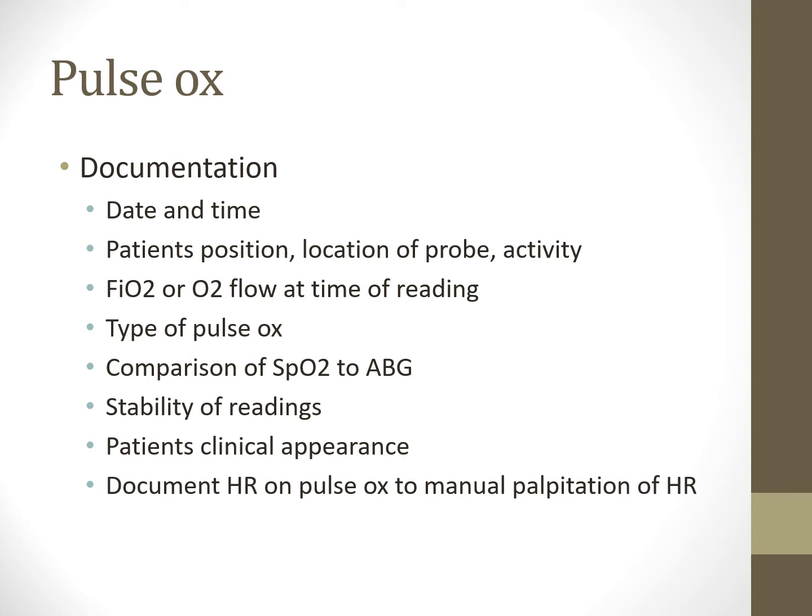So if they're on a continuous EKG monitor, right? So they're in the ICU and they're on a 3-lead, right? You can look at the heart rate on the EKG and compare it to the heart rate on the pulse ox and see how accurately your pulse ox is picking up the heart rate. If the pulse ox heart rate and the EKG heart rate do not correlate, then unless there's something wrong with your EKG leads, it's most likely the pulse ox that's not picking up good perfusion.